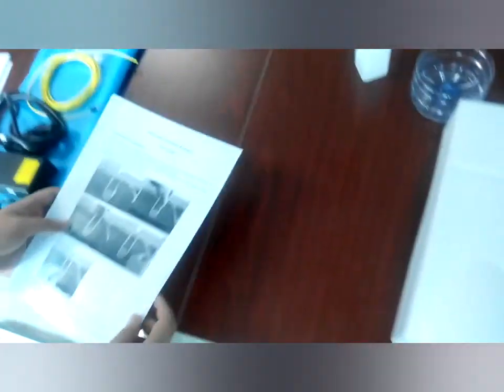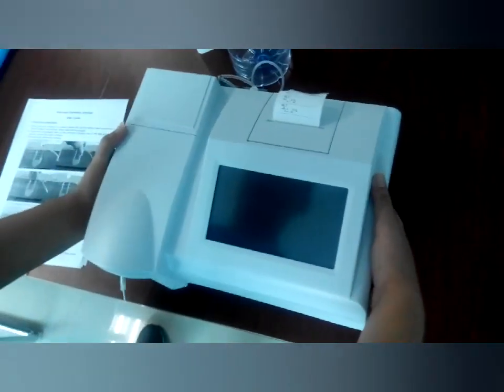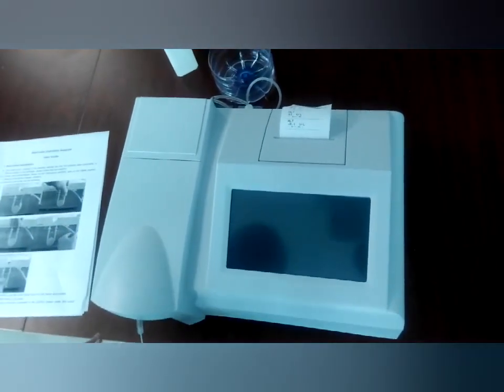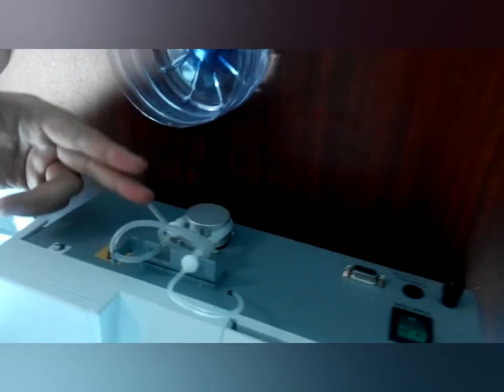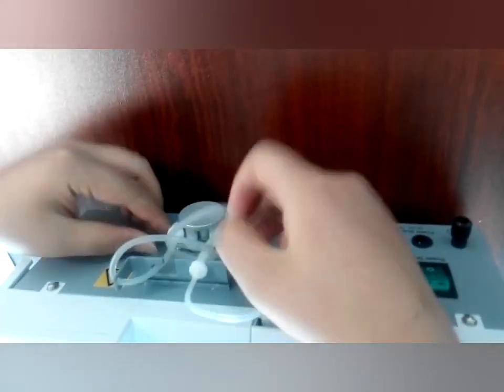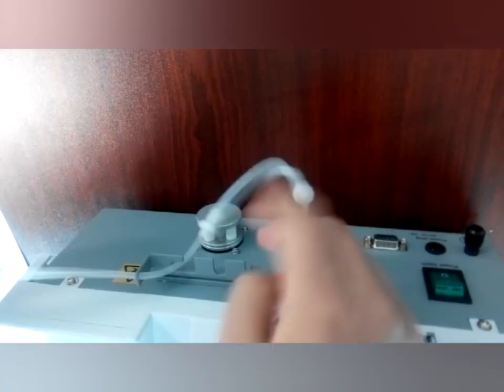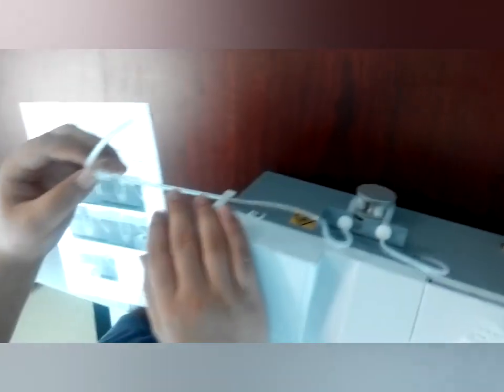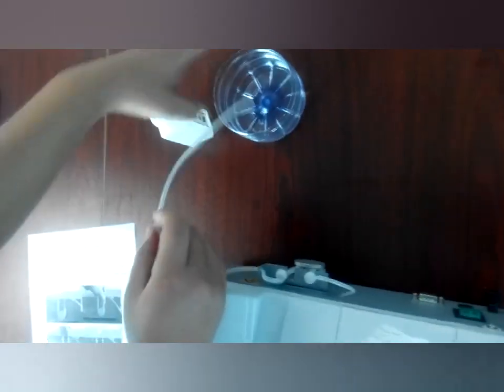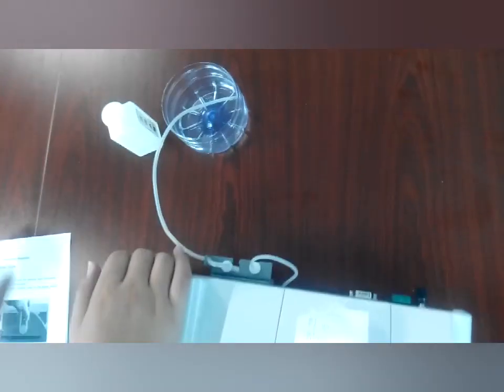Now let me use the user guide to show you how to install and how to test the item using this machine. First, you will see the pump is rolling like this. We should assemble the pump like this. Because this tube is for the waste liquid, we should put it in the waste liquid bottle.